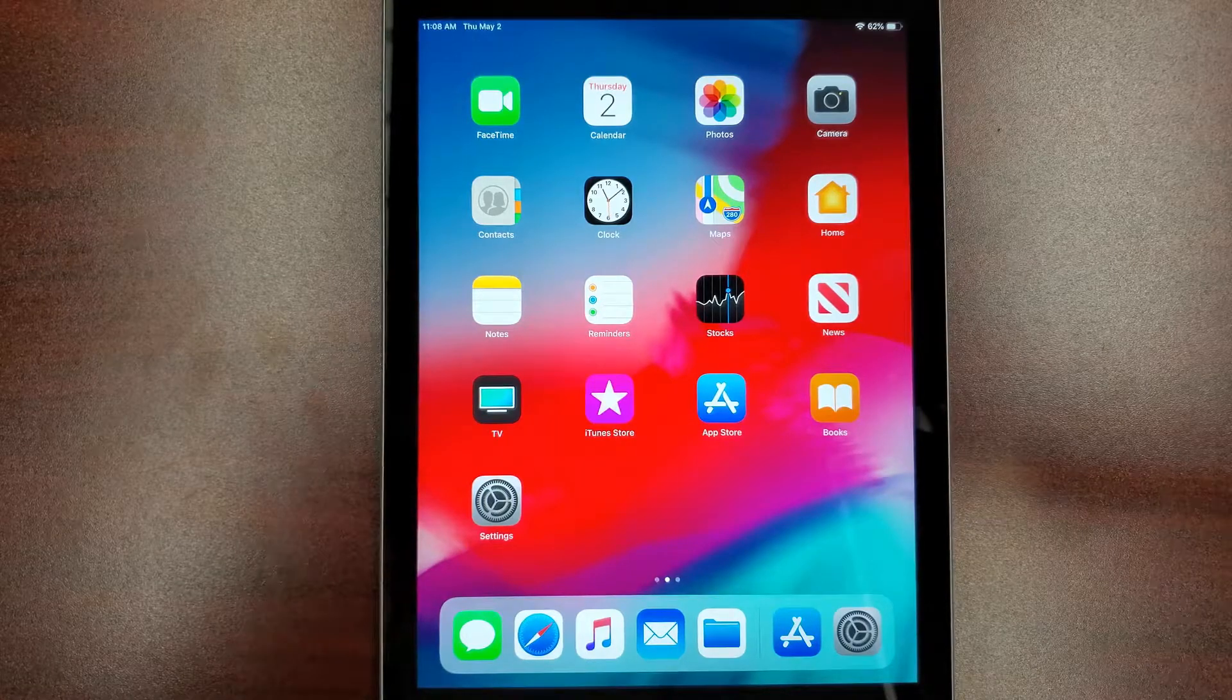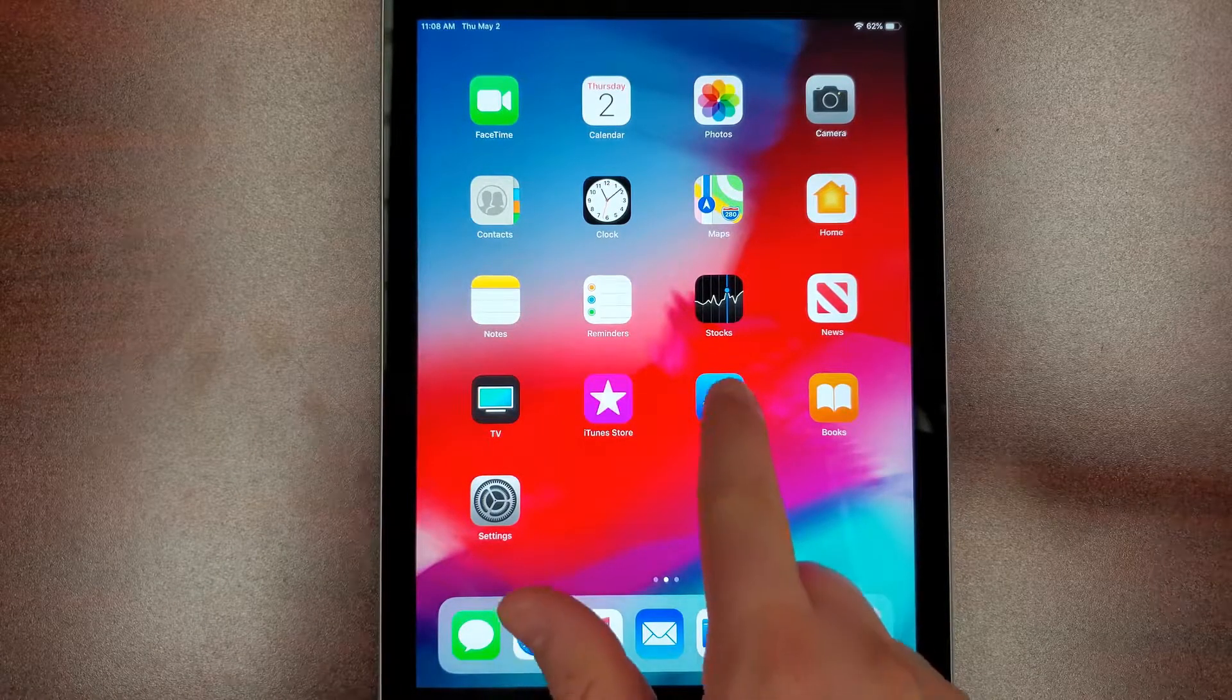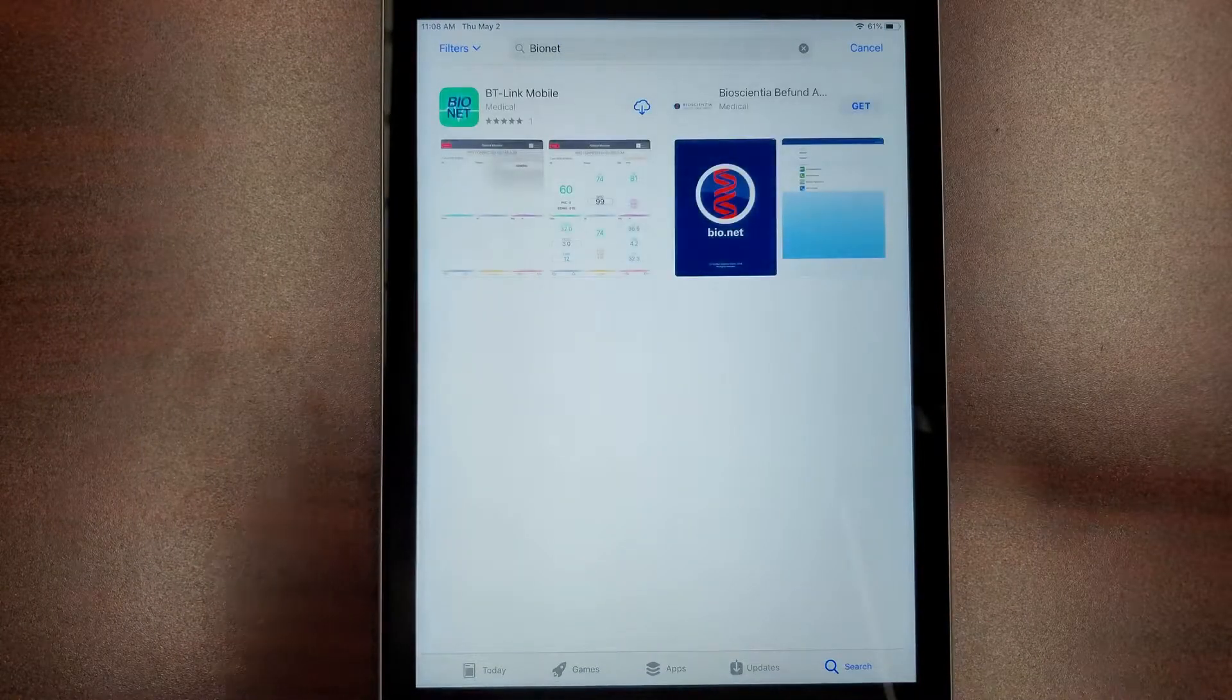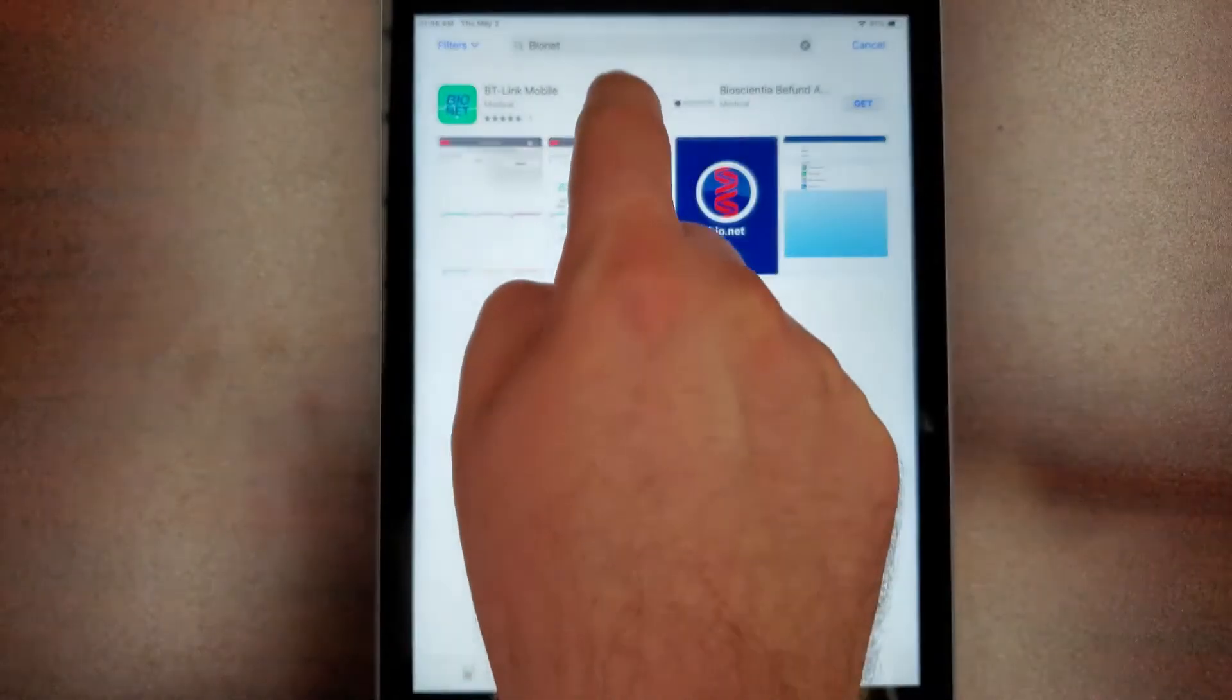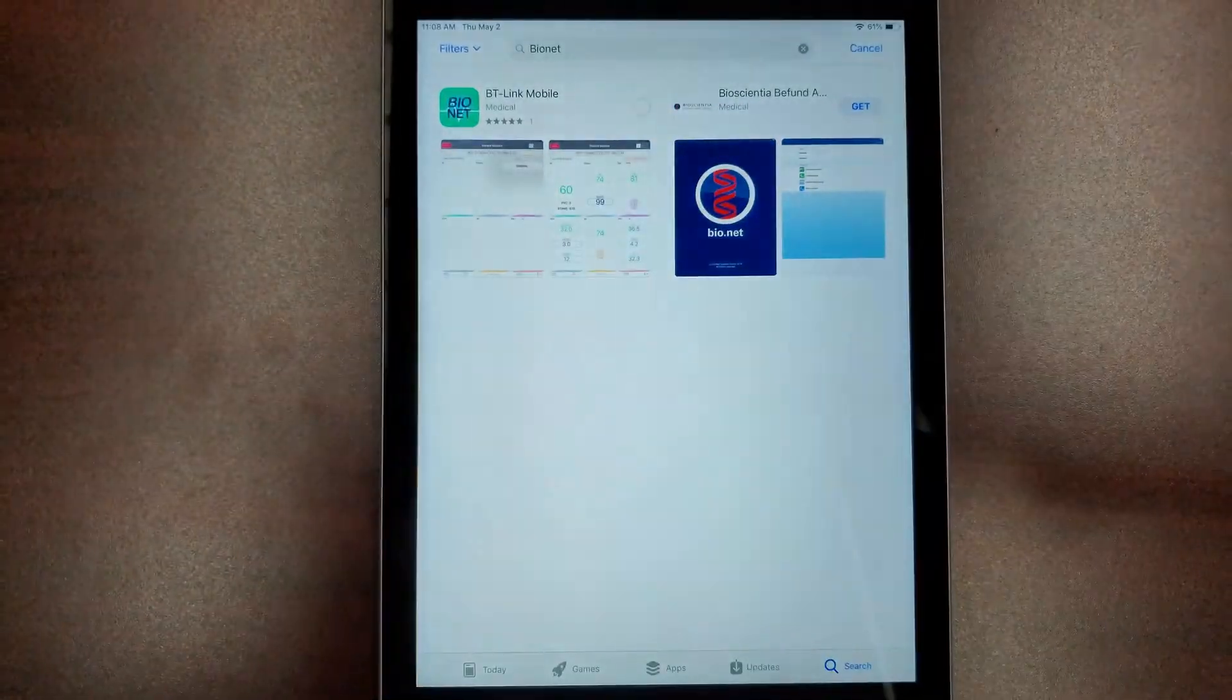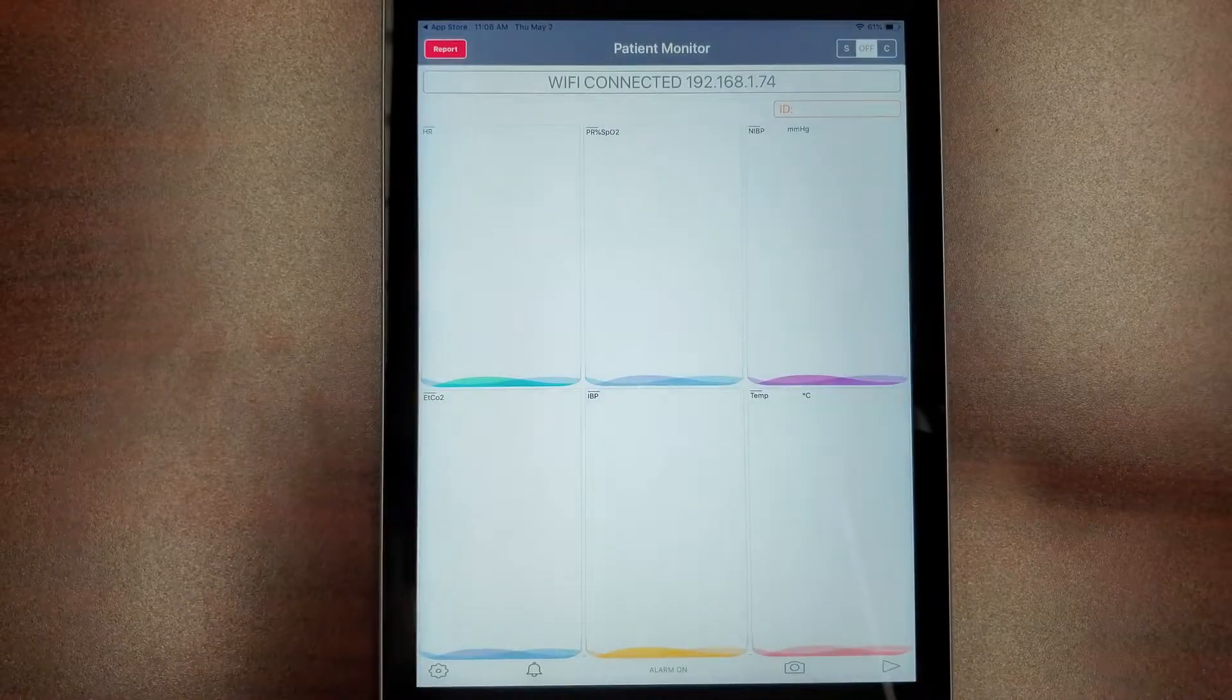To install BT Link Mobile, begin by going to the Apple App Store on your iOS device. In the search tab, type Bionet and click on Bionet BT Link Mobile, which looks like this. Once the app is installed, click on the app icon to start the program.